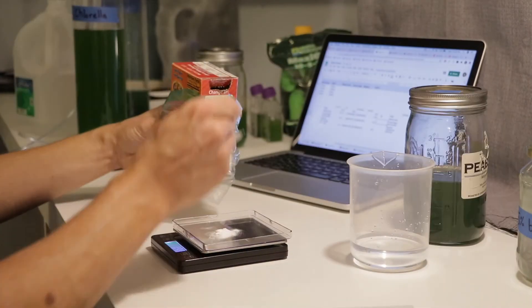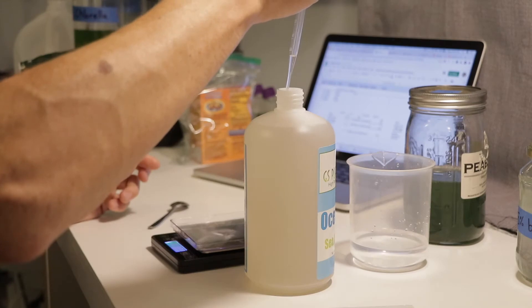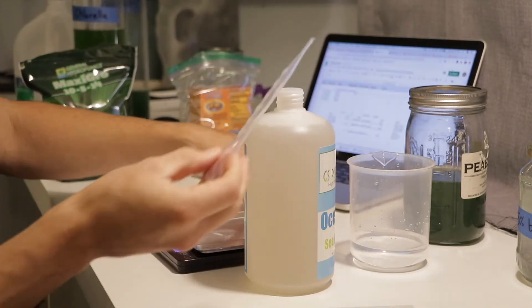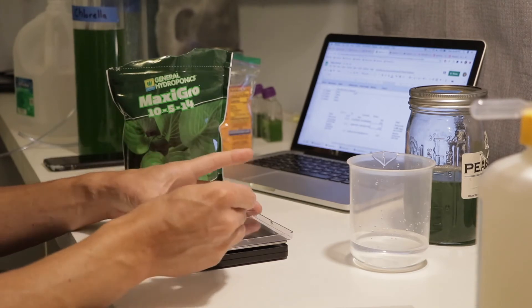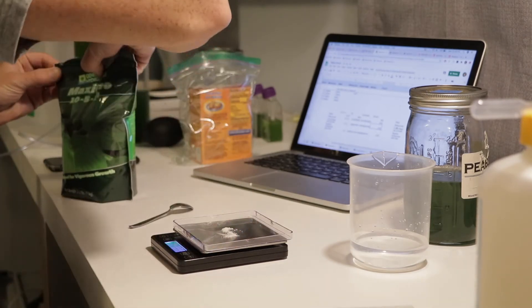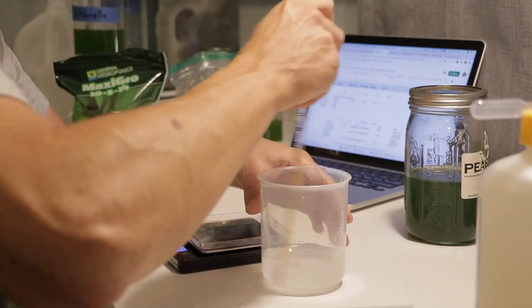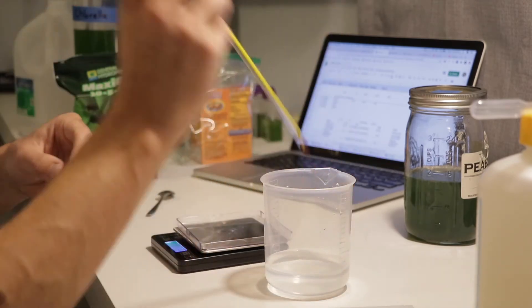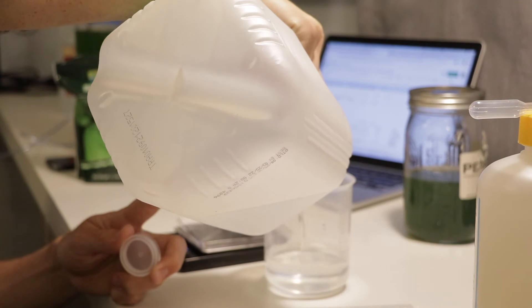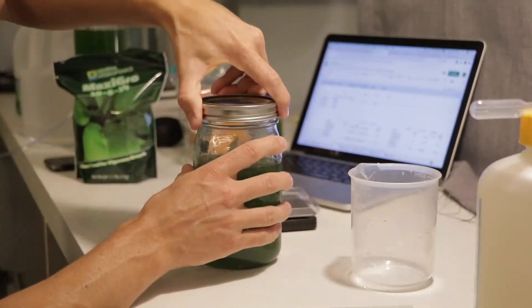A final step for me here is to create more media so I can expand my cultures. I'll link the other videos I've posted where I go more in depth into the proportions and conversions of how much of each ingredient I use to create my media, but basically it's four parts: water, salts, minerals, and nutrients. After you have your proportions, make sure to stir well.